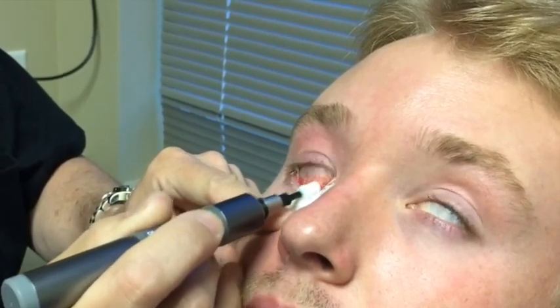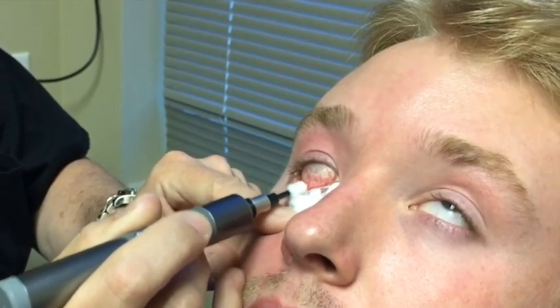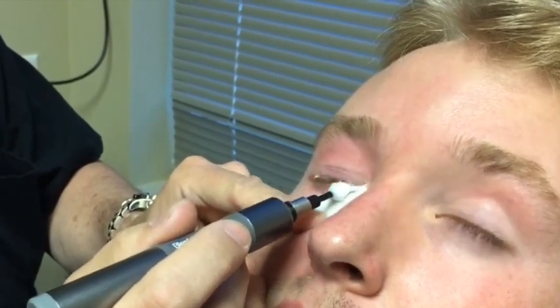Now, this is a very good patient that we're treating today. If I was coming in and I was a novice, and this is a very common mistake that early BlephEx users make, is they'll want to be gentle to the patient and they'll come in and they'll treat very lightly.